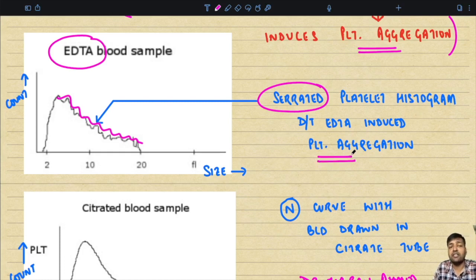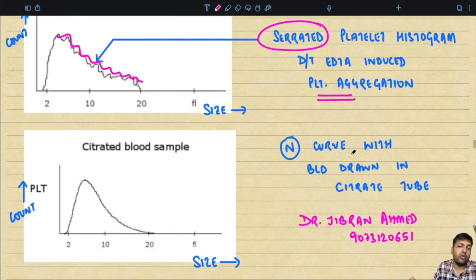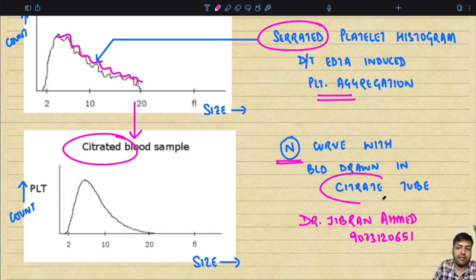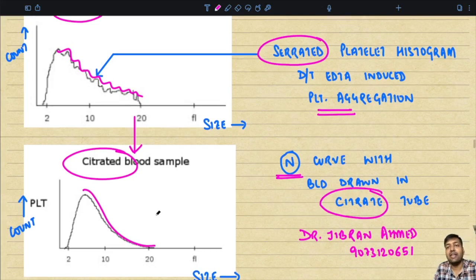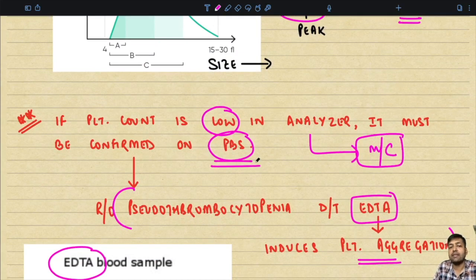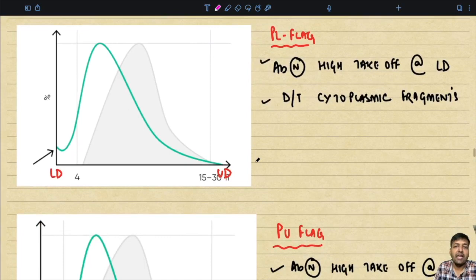To confirm EDTA-induced pseudo-thrombocytopenia: when you examine a platelet histogram from an EDTA-collected sample with platelet aggregation, you will see serrations in the platelet histogram curve. If you instead collect blood using a citrate anticoagulant, the curve returns to normal with no serrations. This proves that EDTA was falsely inducing pseudo-thrombocytopenia by causing platelet aggregation. Therefore, whenever the machine gives a lower count, always confirm on the peripheral blood smear.